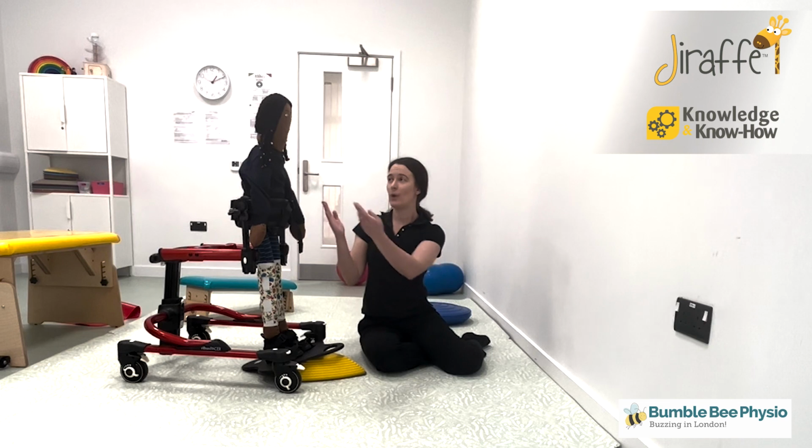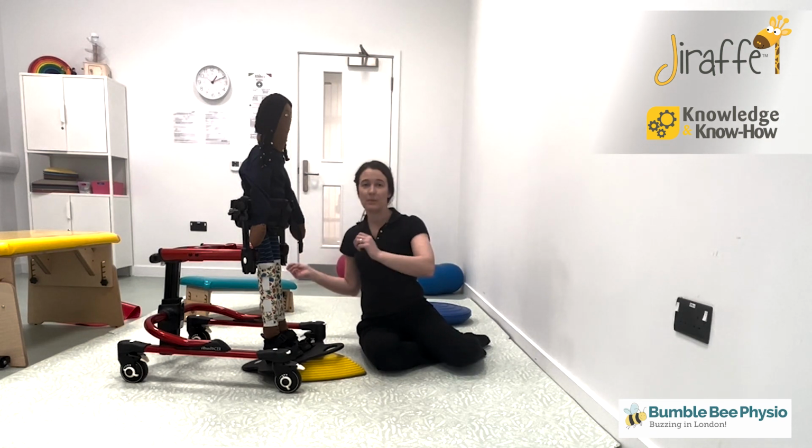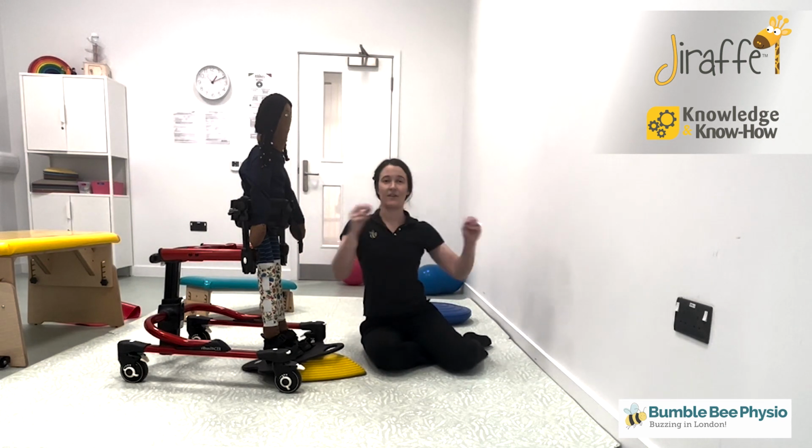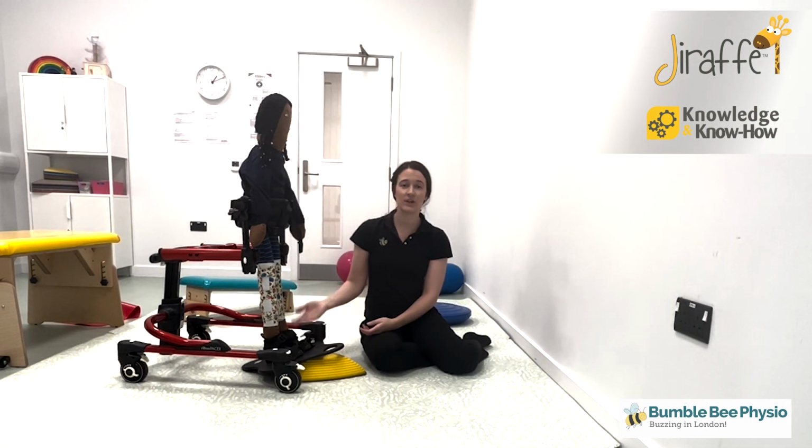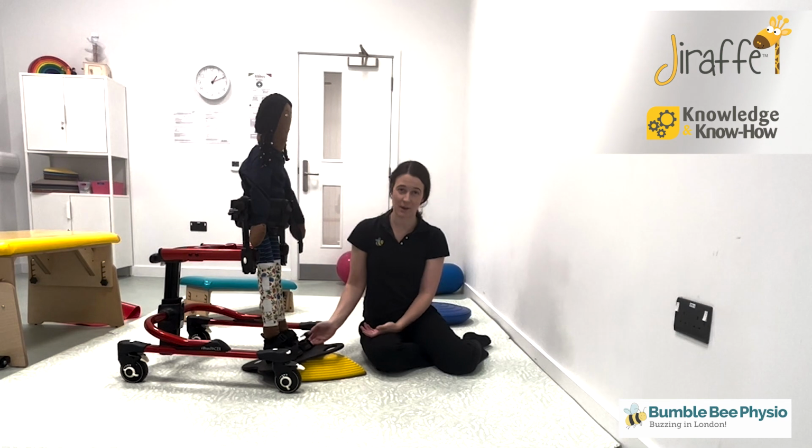Whatever you're using, when your child is upright, if you get them weight bearing and reaching and twisting around their trunk, reaching for different toys, looking at different people, you're going to really add in lots and lots of dynamic factors to this very active gastrocnemius stretch. I hope you found this useful.